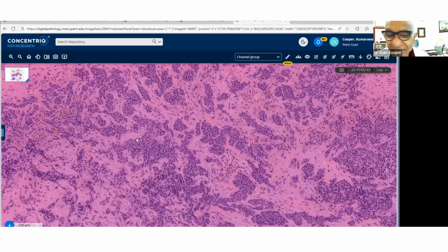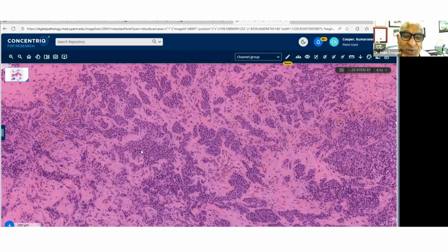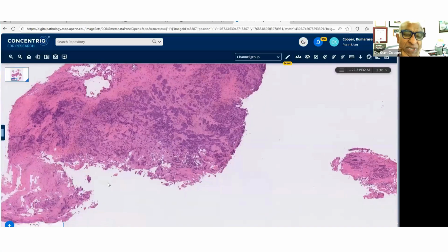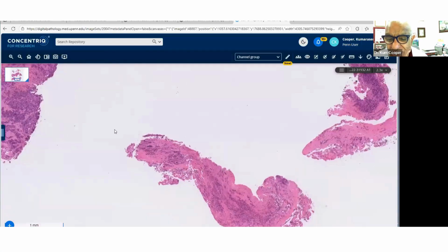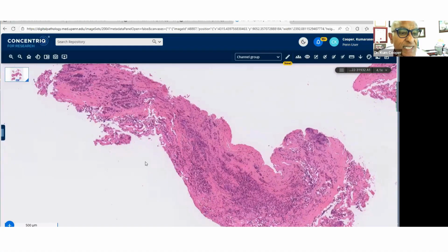Okay. Yeah, so there's an epidural tumor. Not sure which part of the dura. 42 female. And you can see there's a lot of cautery artifact, but this particular section shows, I think, well-preserved tumor. So I'll stick with that.